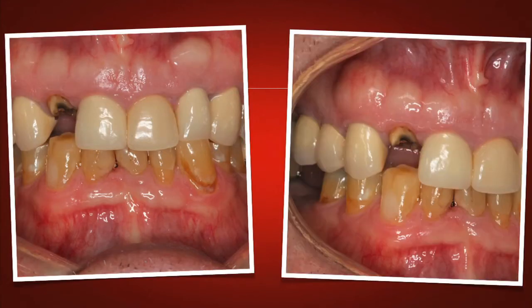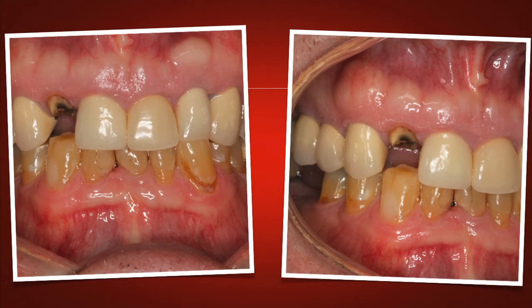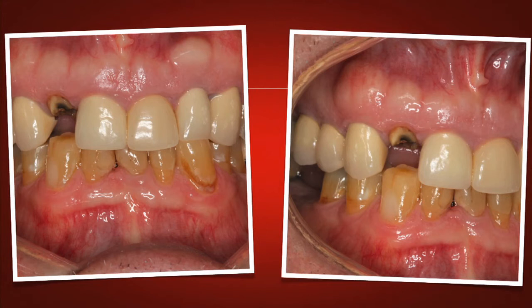If we take a look at his retracted view in centric occlusion, we can also see the type of clearance that we have, his general occlusal pattern, and how this wear of his lower teeth may affect our long-term treatment planning. We can also notice some buttressing bone on the upper and lower.